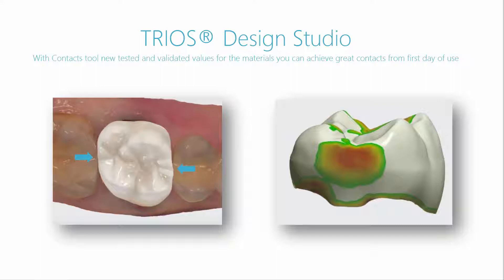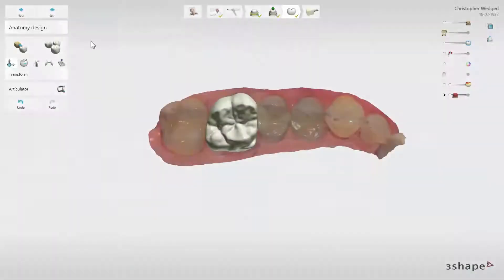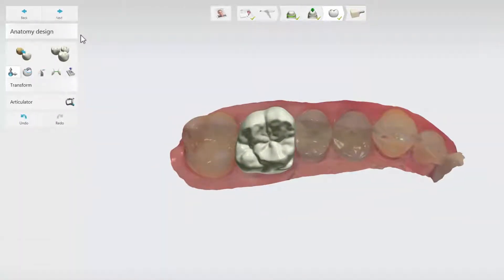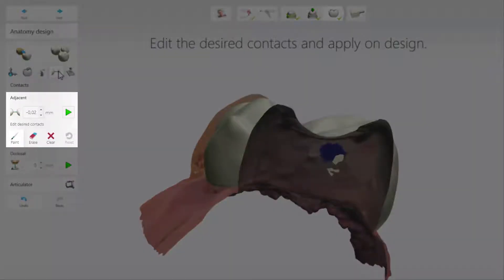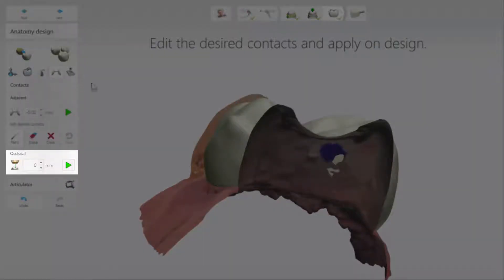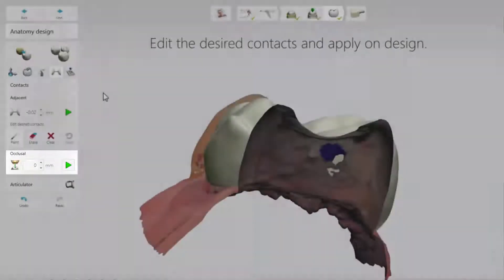This means you have to spend less effort on grinding and finishing to get the perfect fit. The Contacts tool can be found in the anatomy design step among the design tools. This tool gives you a great opportunity to adjust the contact points on your design, both for contacts with adjacent teeth as well as occlusal contacts with the antagonist.